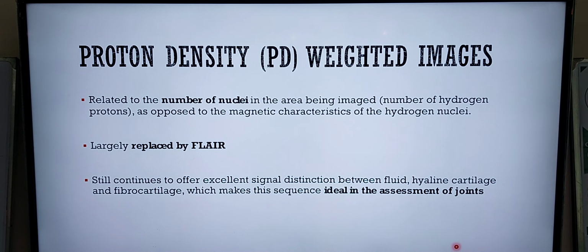It still continues to offer excellent signal distinction in the assessment of joints because it differentiates fluid, hyaline cartilage and fibrocartilage. So it can differentiate structures of the joints.